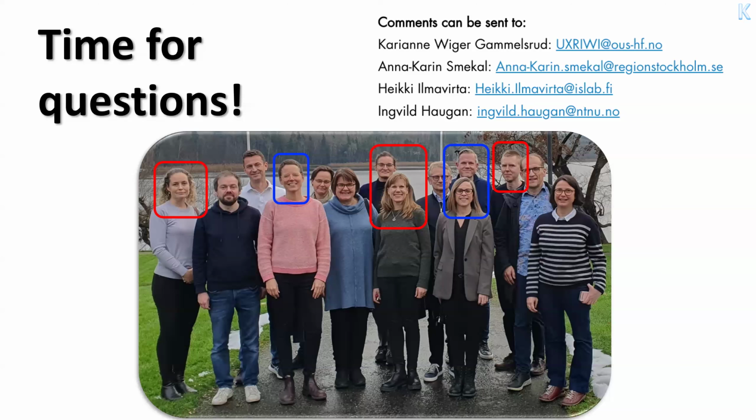Yes, at least I agree with Linnea, who asked the question that if it's IE in the table, then the expert rules shouldn't say reported as susceptible. That is totally correct. So that should be corrected in the expert rules. Regardless, they can be considered wild type, but they should not be reported. So it should be reworded. I think this is a very fair point, and we will check that this message is transmitted onwards to those who are responsible for the expert rule revisions.